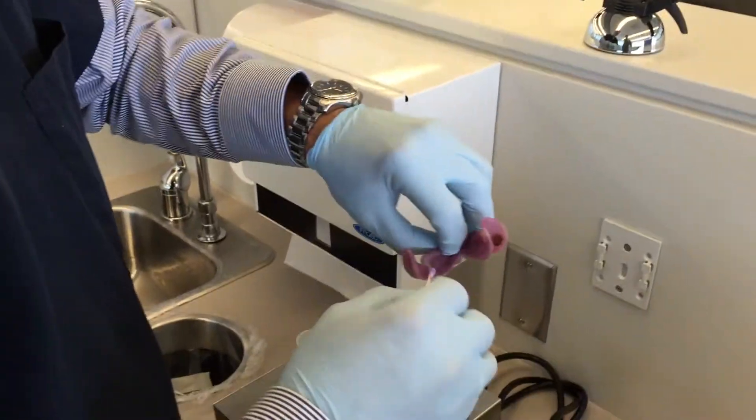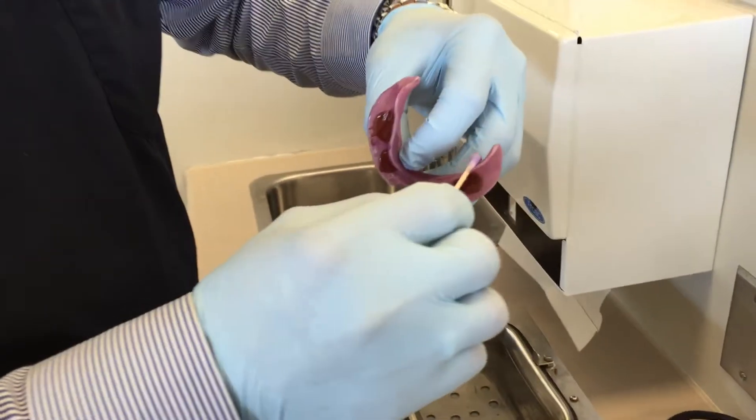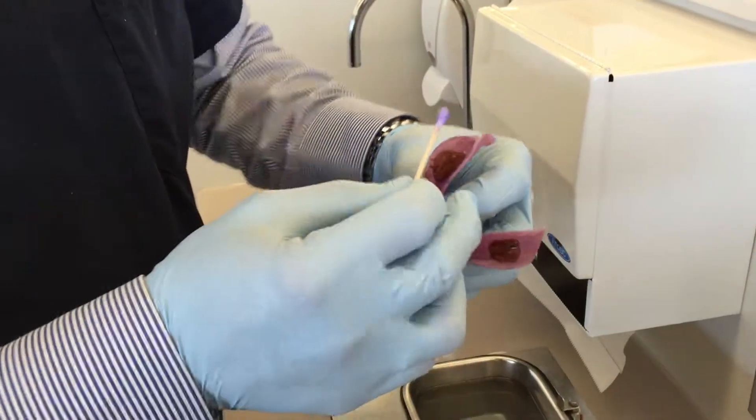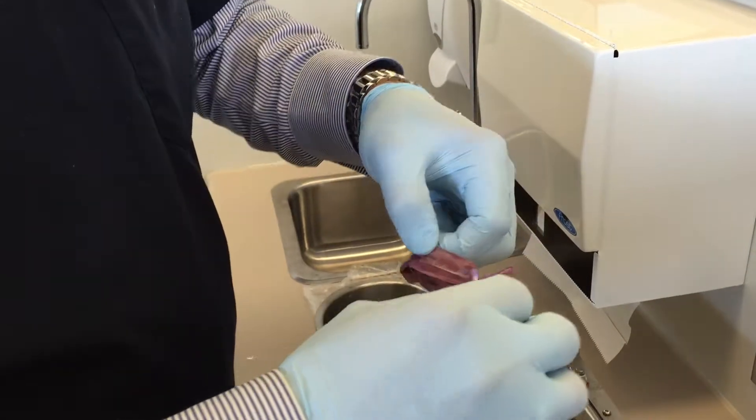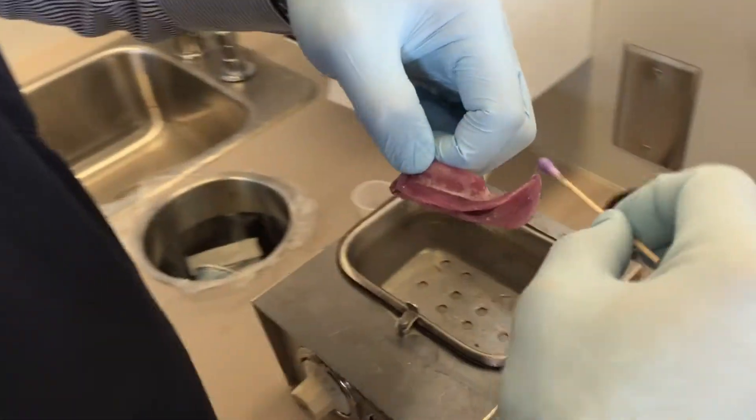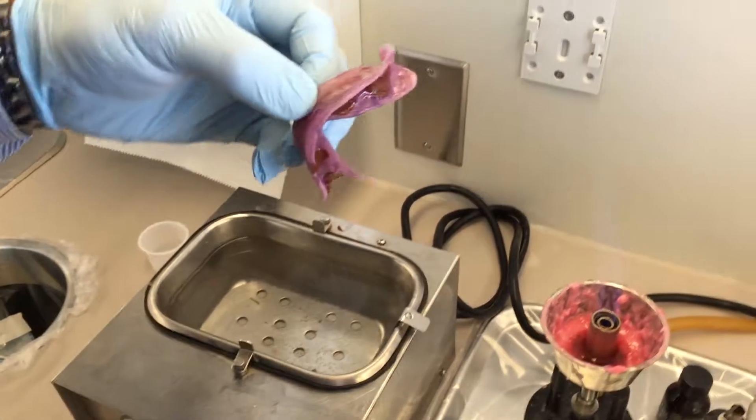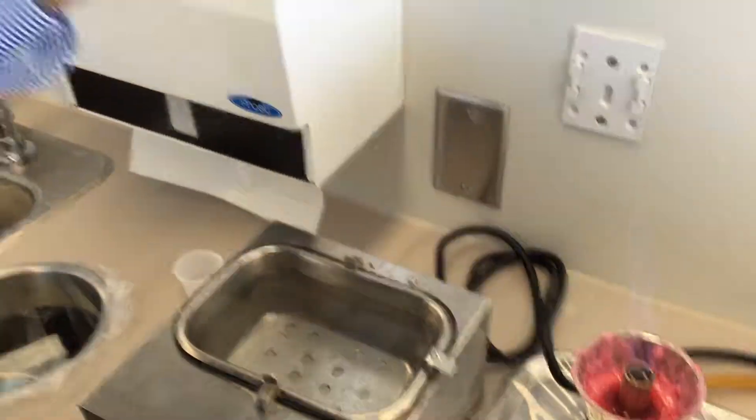So make sure that you put an ample amount, and as you notice here that I went to the periphery and a little bit past it, to make sure that the material, as it comes up and around and wraps around the tray, adheres to the tray quite nicely and doesn't pull away.